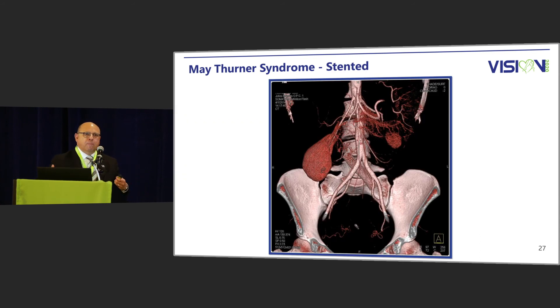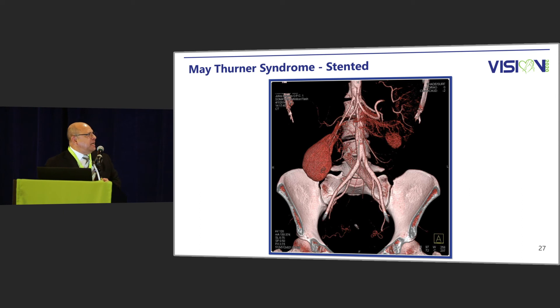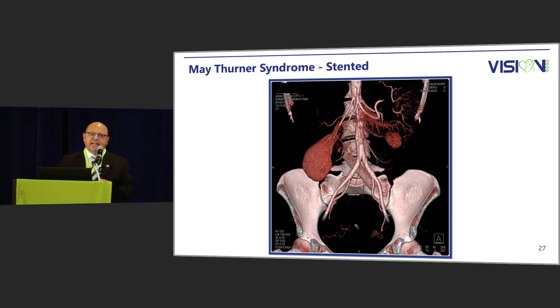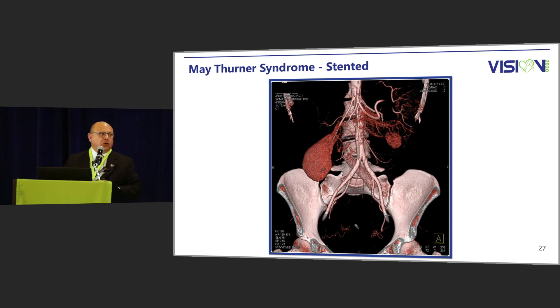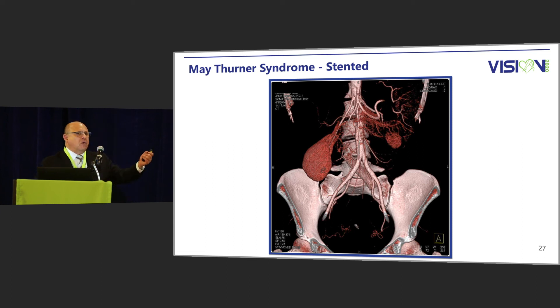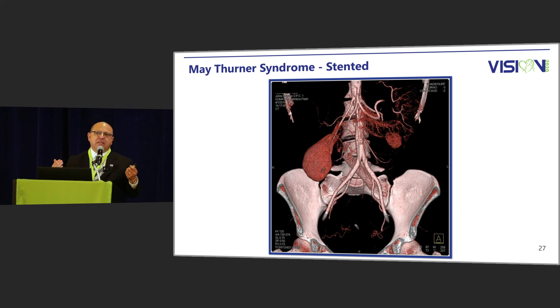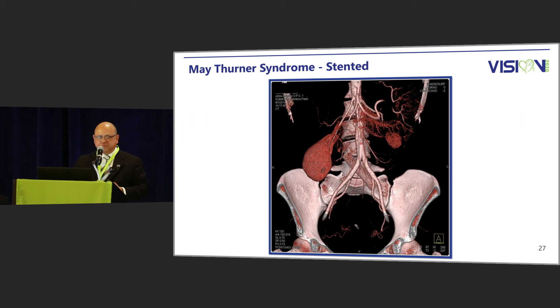Post-treatment — from Elliot Fishman at his Hopkins lab — you can see the stent has been placed into the stenosis, and on axial images you can see flow inside the stent.